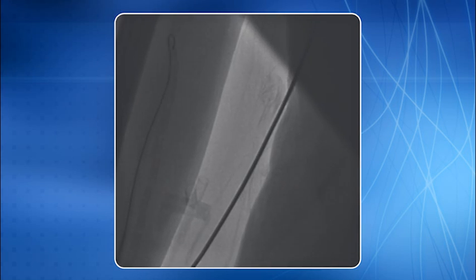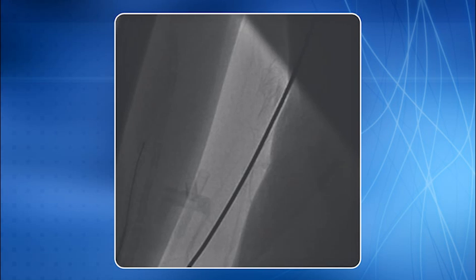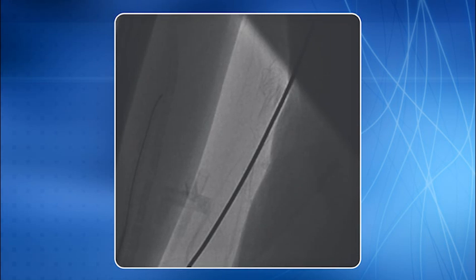This is a nice example of radial and ulnar artery calcification. You can see a clear cut tram track sort of calcification in the root of radial and ulnar artery. The wire is being very carefully negotiated through this calcification. You have to make sure that when you pass the wire through this situation, you negotiate it very carefully. You will encounter some resistance, but fine, the wire will move on.